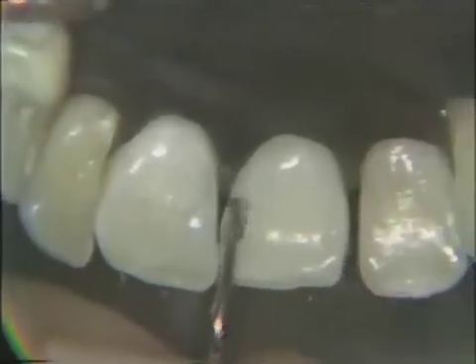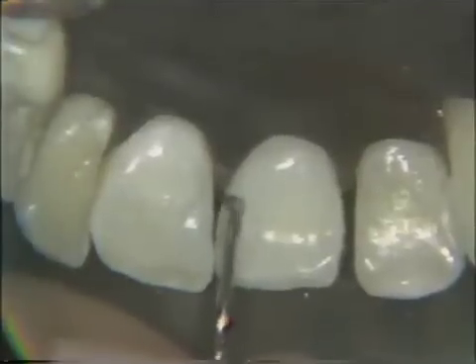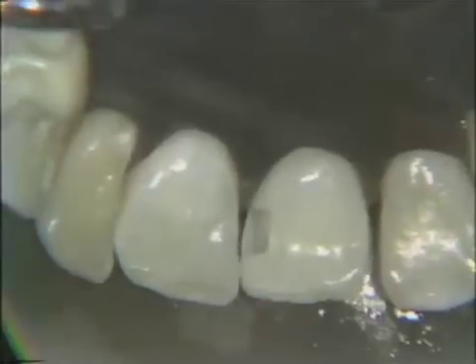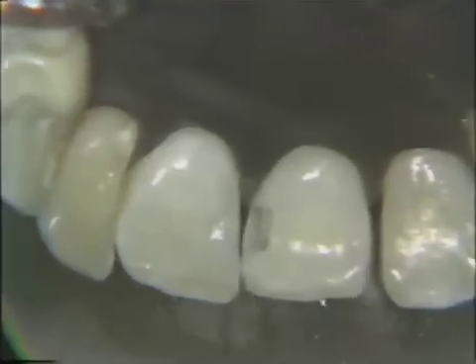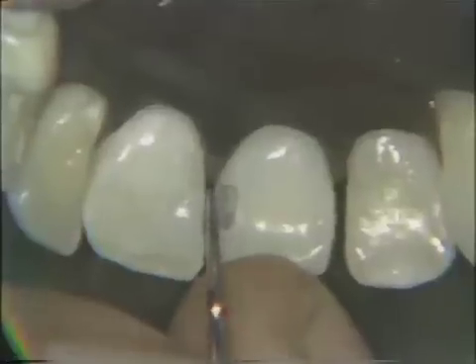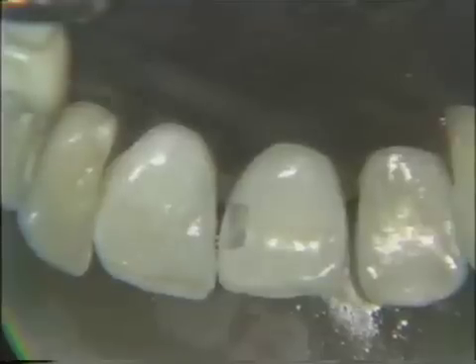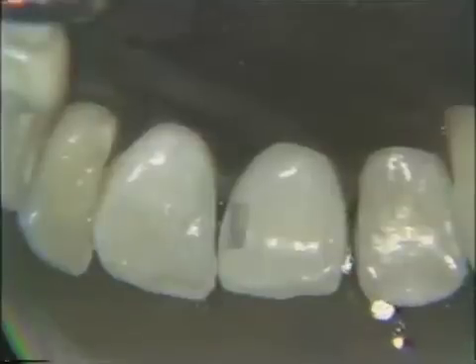Now, our final refinement of this preparation is done again with a hoe. If you notice the look of this enamel now, it's beautifully sharp. There's no decalcification left on the margins. We're using the hoe on the end to scrape the labial and then come down to the incisal. Notice that. Rinse off your debris. You cannot see into a cavity that is filled with debris.